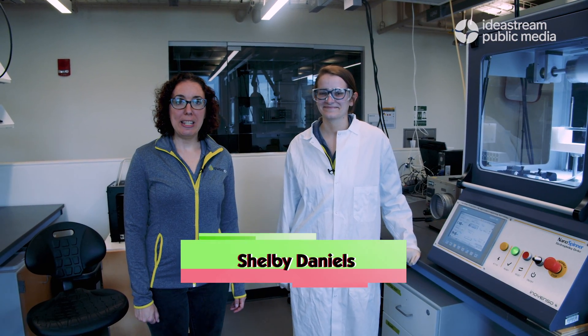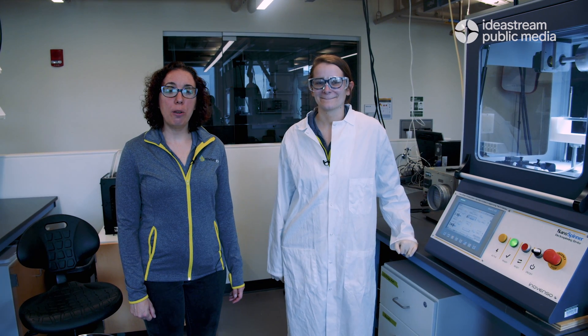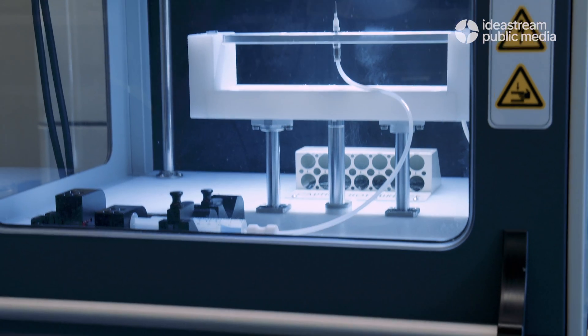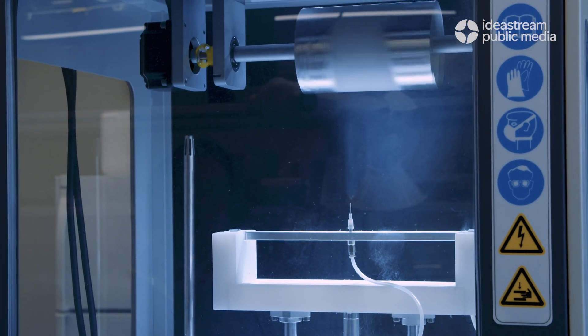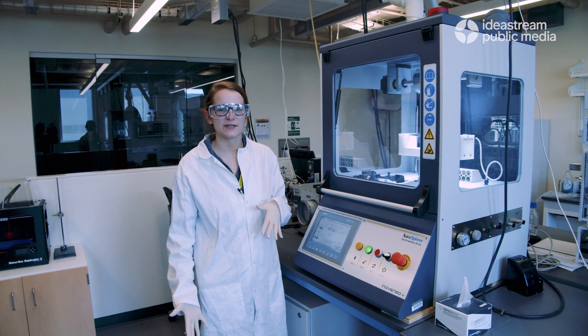Now I'd like to introduce Shelby Daniels, our chemical engineer at Sweat ID. She's going to walk you through how we make the non-woven fabric that we use as the base for our sensor. This is our electrospinning box. With this we make nylon mats that we then treat and transform into our sensors.